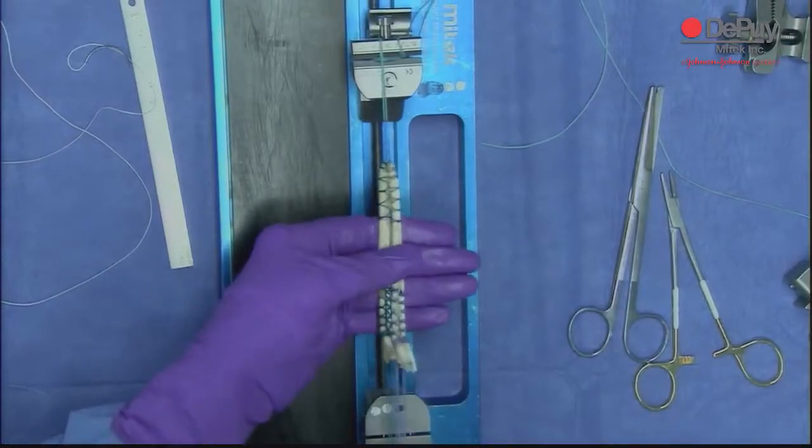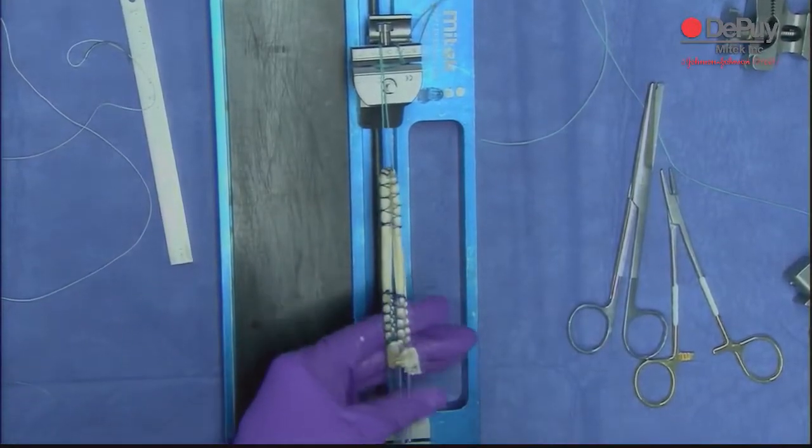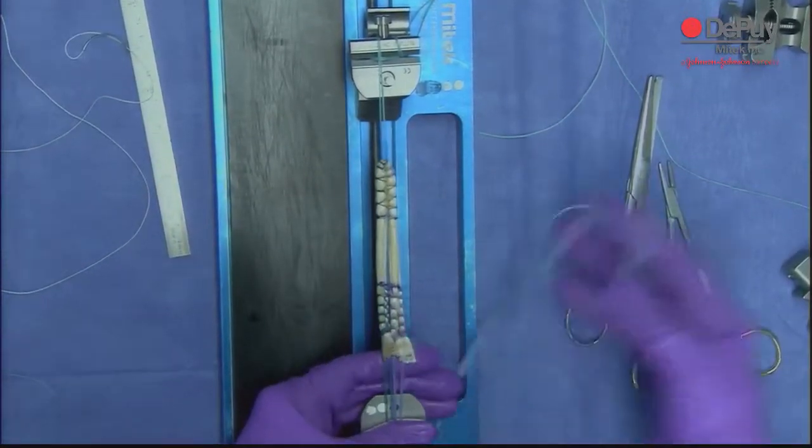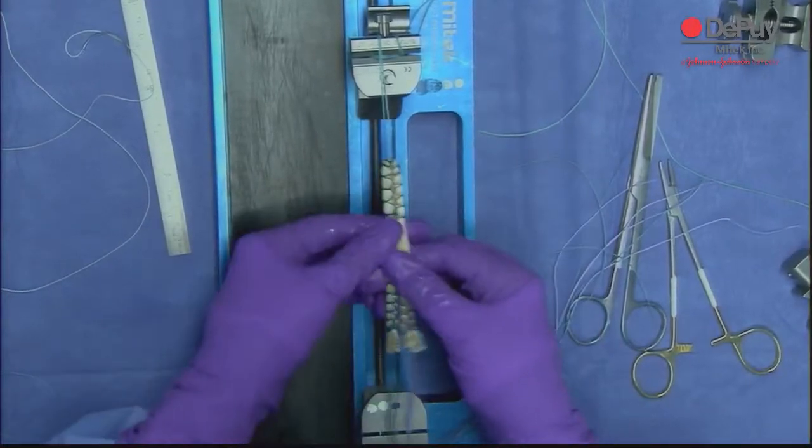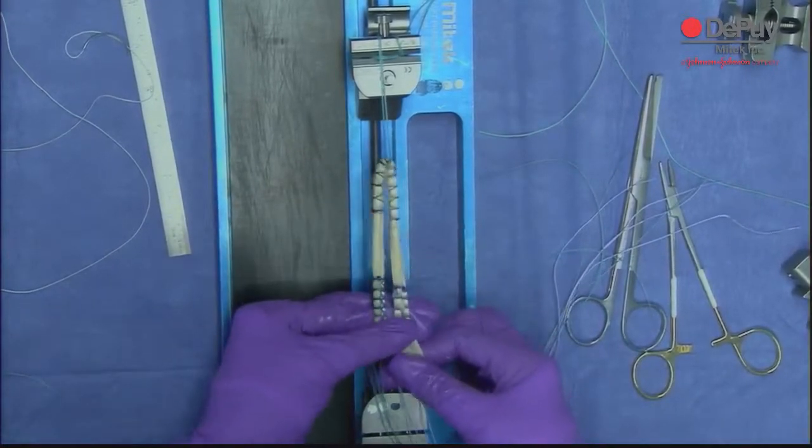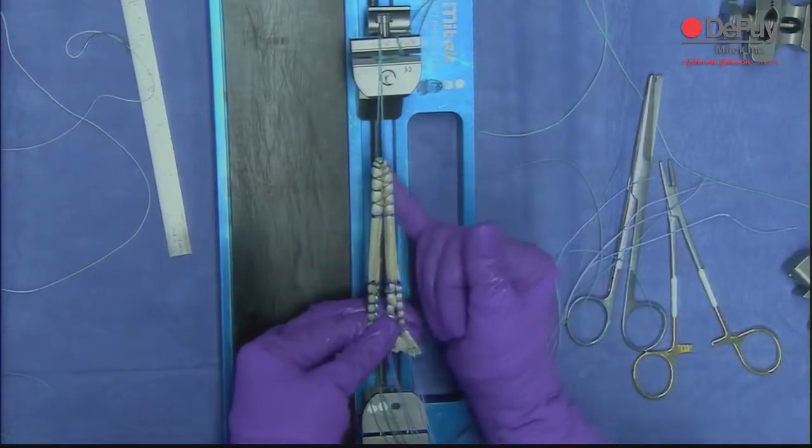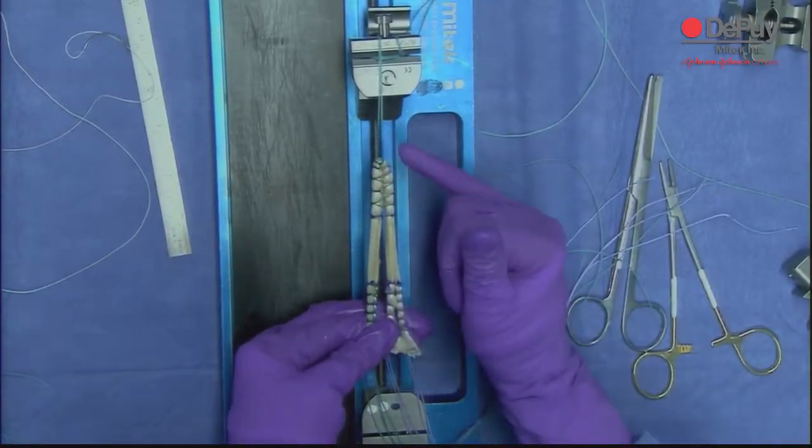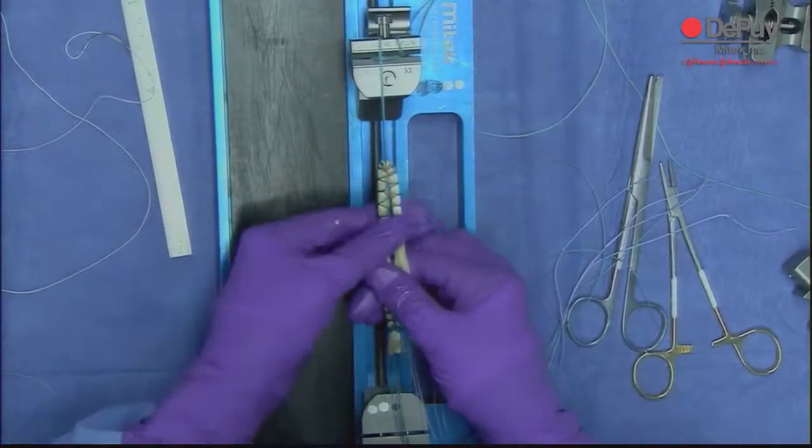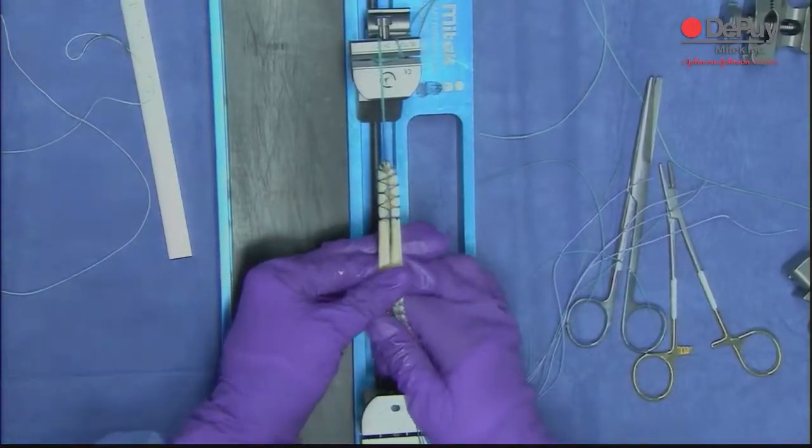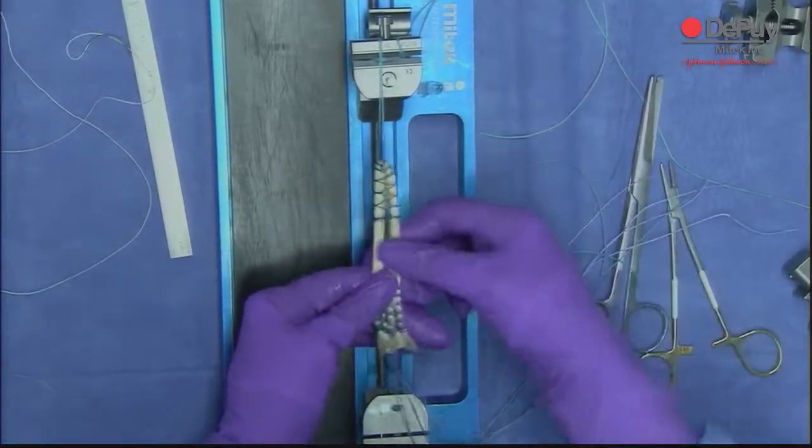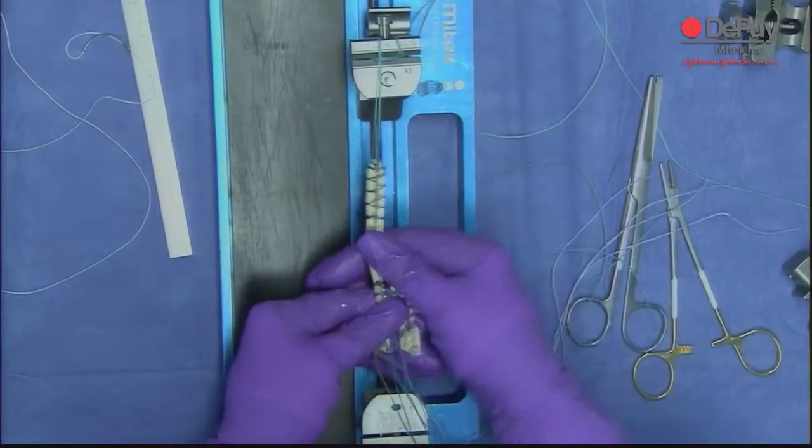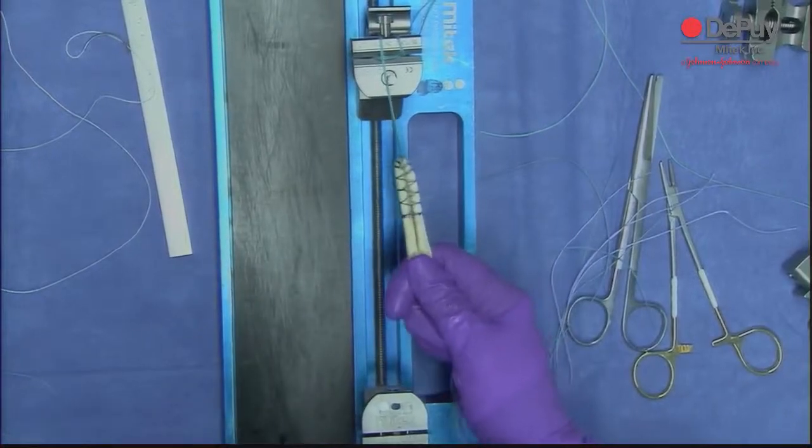So that's it, that's the modified finger trap suture technique. Down here, up here, down here I use number two ethibond, number two orthochord. Up here I used either zero or two-O, because you have to upsize the tunnel on the femoral side, so I use a smaller suture. All you're doing with this suture is making two bundles. That's it, we're done.